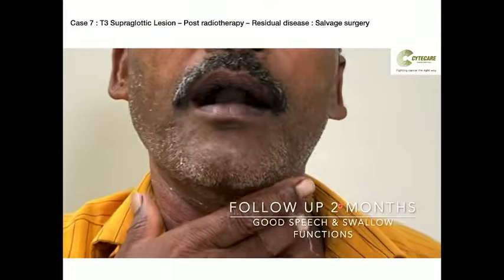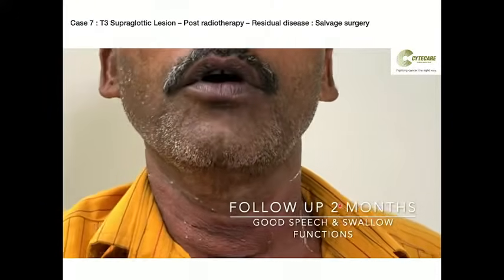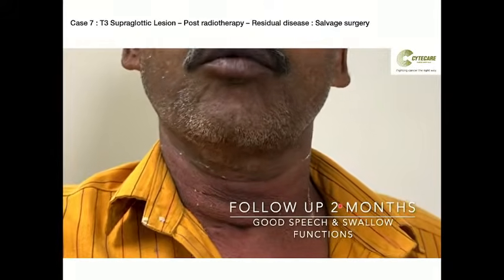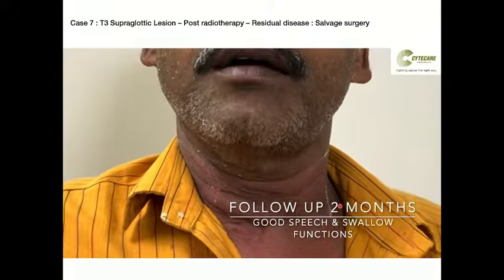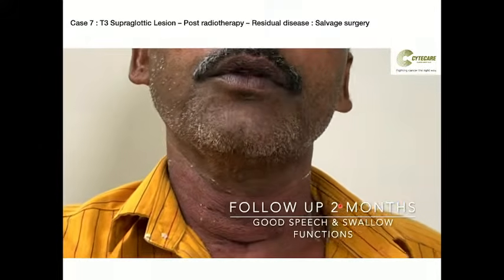And this is the endoscopy at 2 months. See how beautifully it has healed. Such an extensive resection in a salvage situation, post-radiotherapy. Vascularity is bad, everything is bad, right? But still the outcomes are good. But there should be a young patient, good mouth opening, good exposure, and good disease to remove as well.